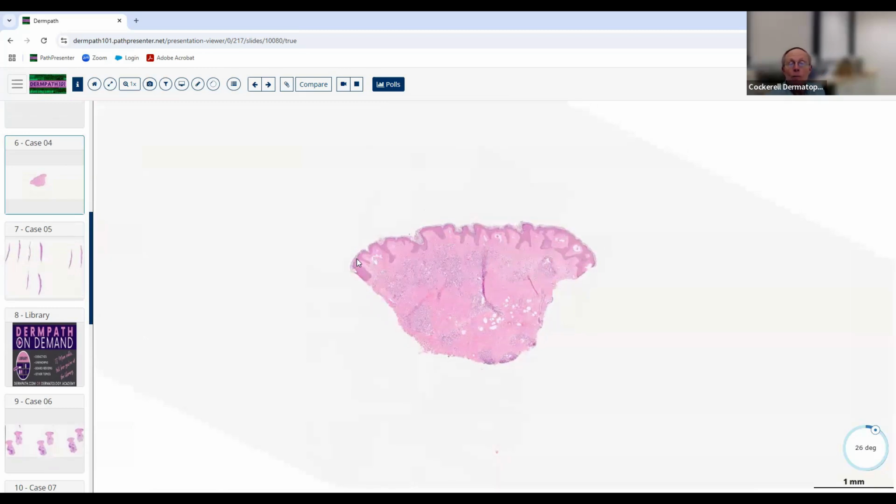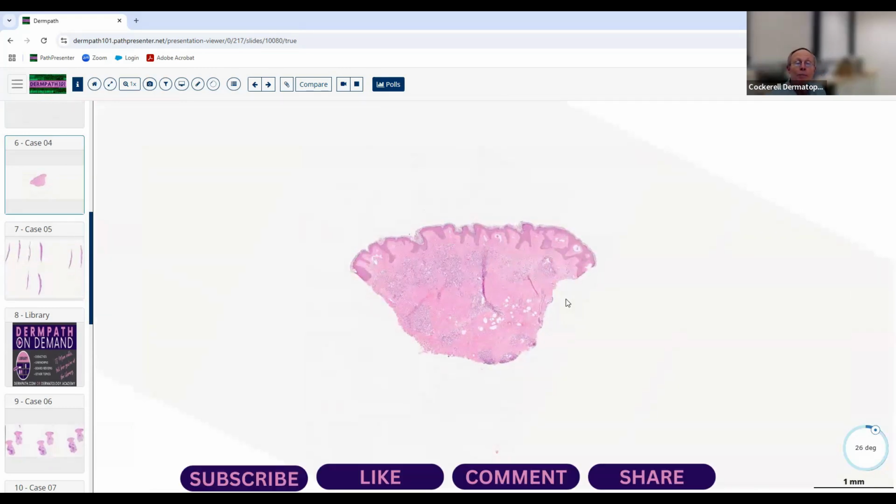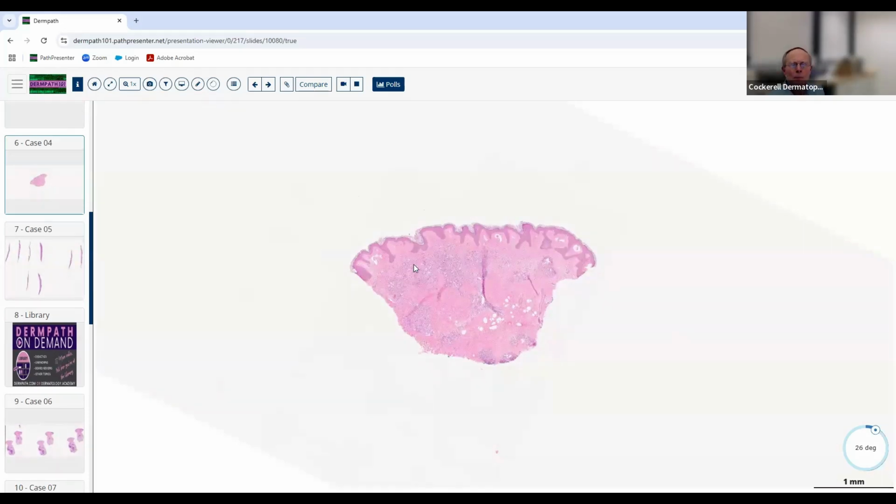So again, you say, well, punch biopsy, maybe inflammatory, but if we look at low magnification, it's got some little dark cells here, but certainly doesn't look like they're lymphocytes. We notice there are some little clear staining areas up in this area, little holes throughout the lesion. So we see things at low magnification like this. We say, well, there's blood vessels in here, most likely. It's vascular, at least to some degree.